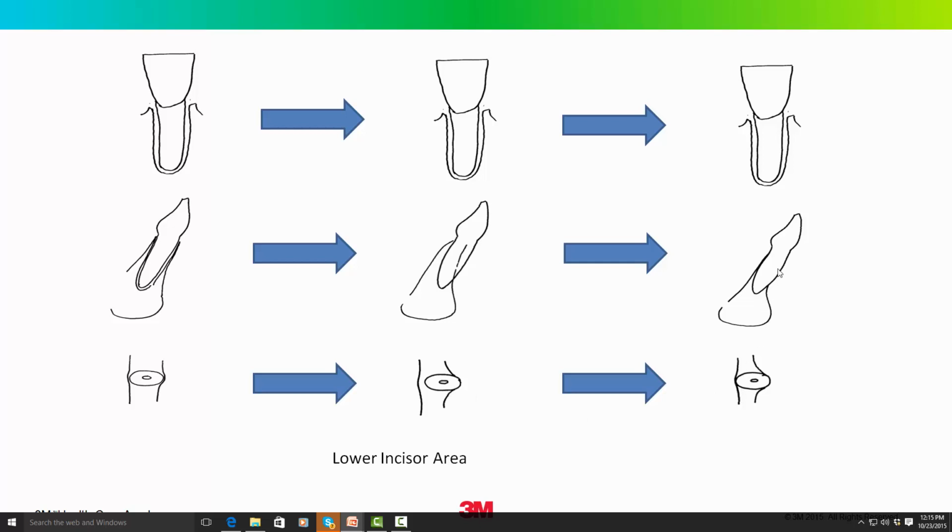Now, sometimes you hear reported in literature that there's a flexure or a bending of the alveolar process as the lower incisors move. Well, that's based on what's being observed on a cephalometric x-ray. Once you start looking at individual teeth using cone beam CT, I think you'll find that that flexure or bending or alveolar dental change is really just an artifact of the two-dimensional cephalometric x-ray.